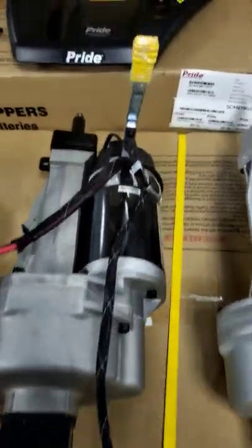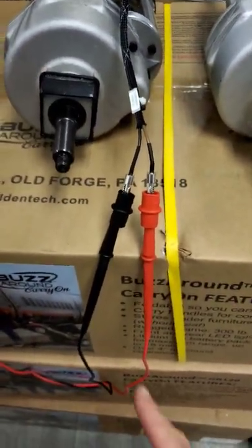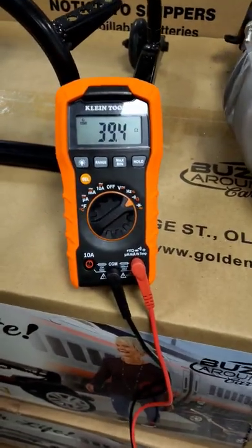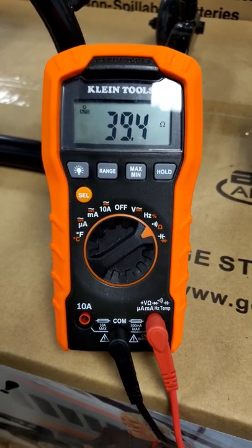So as you can see here, I have the motor and brake assembly out already, and I'm testing the leads directly. And I have my multimeter here. It's set on auto range for ohms, but if you needed to, set it to about 200.